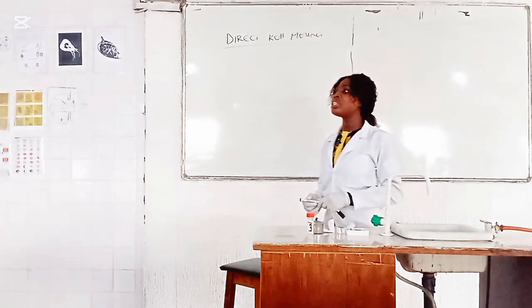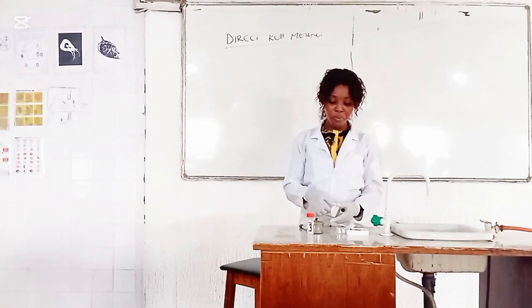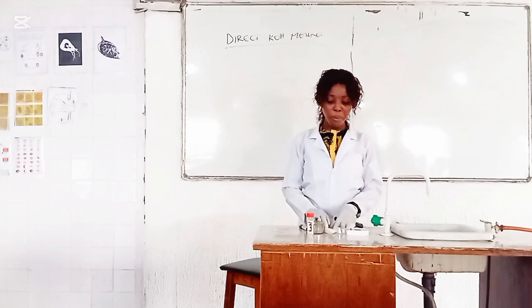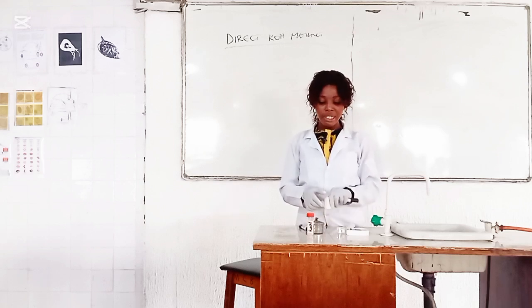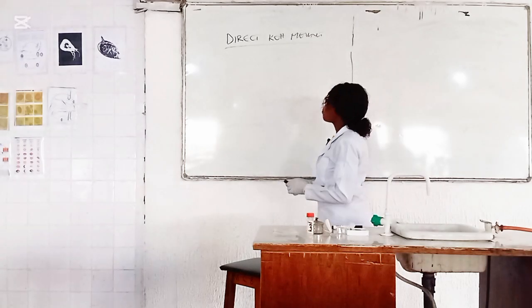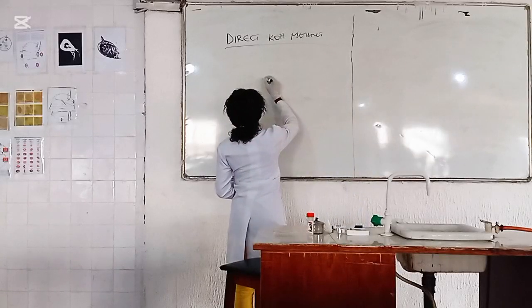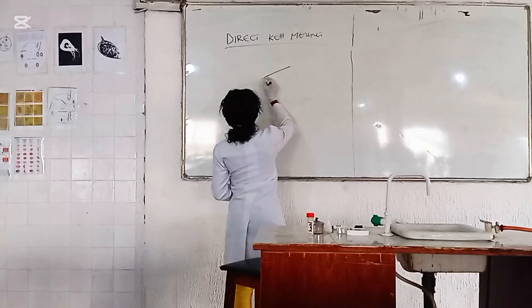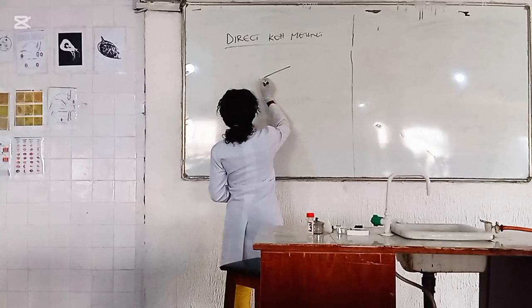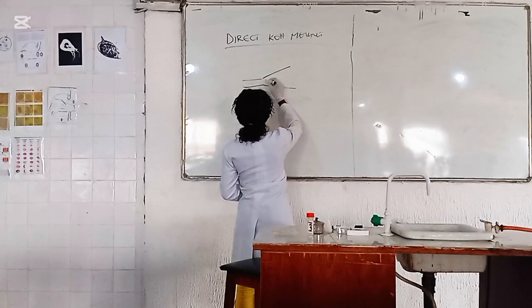So when carrying out KOH, you obtain the sample. Like for today's learning purpose, we have a hair sample. When you carry out the test, you have to obtain the sample into a sterile paper, just as we have here. Now the shape of these fungi, when you view a KOH preparation that has fungi under the microscope, you may see something like this.